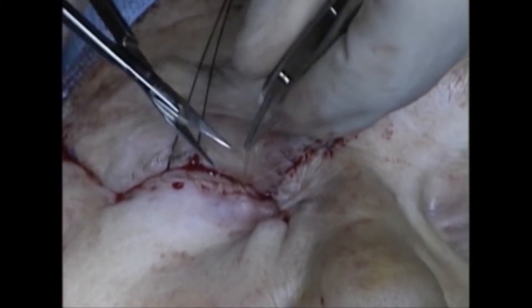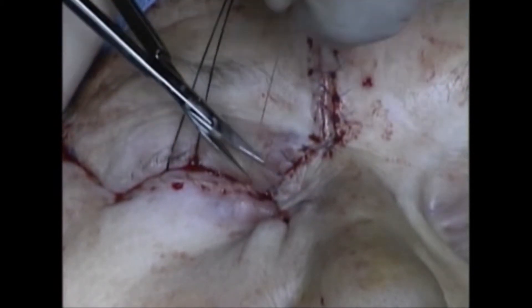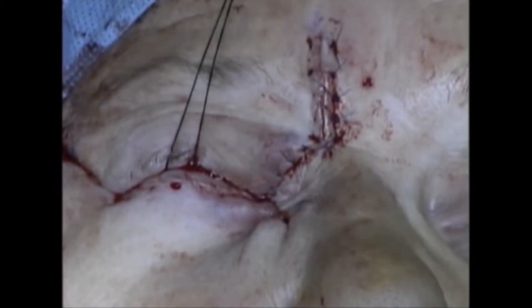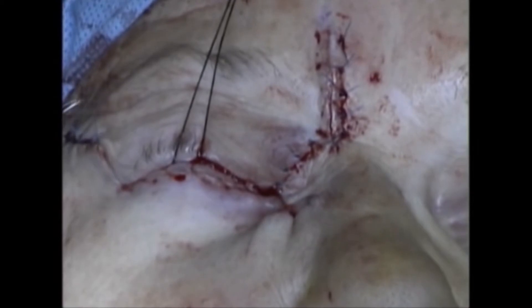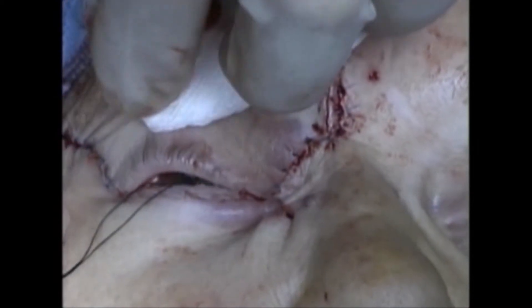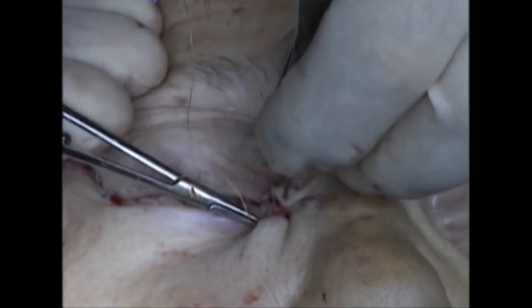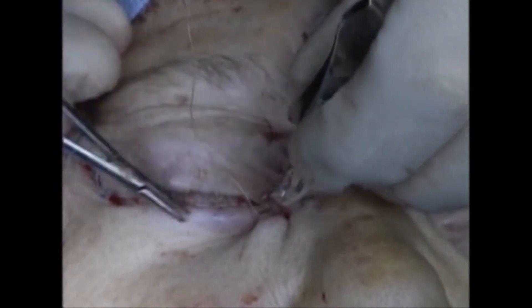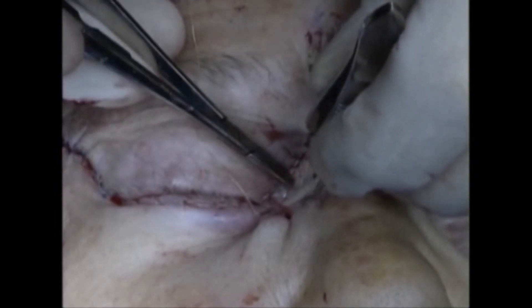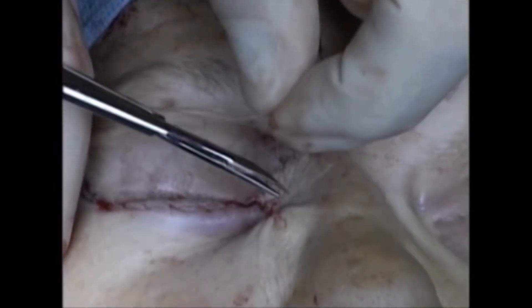The glabellar flap is then sutured to the Mustardé flap with interrupted 5-0 fast-absorbing sutures. At the conclusion of the case, the defect is closed with minimal tension with the lid in good position and the skin types respected. The patient returns in one week for suture removal.